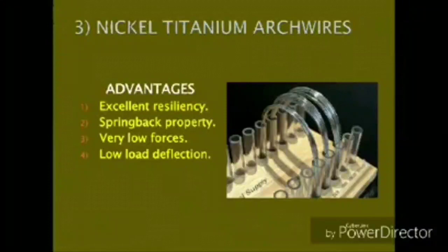Another big advantage of nitinol archwires is that they have low load deflection rate, which clinically means that whether the tooth is a little out of arch or much out of alignment, when the wire is tied, the tooth will experience the same amount of force. This is an extremely desirable property because very low and constant forces are provided by the archwire during the tooth movement.